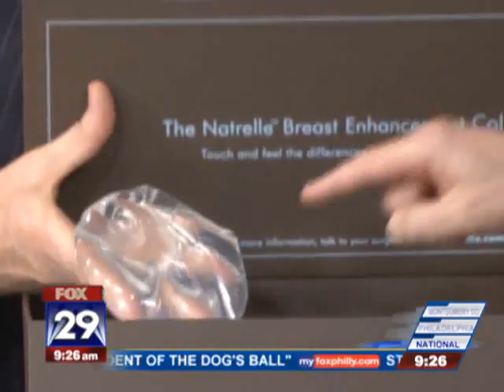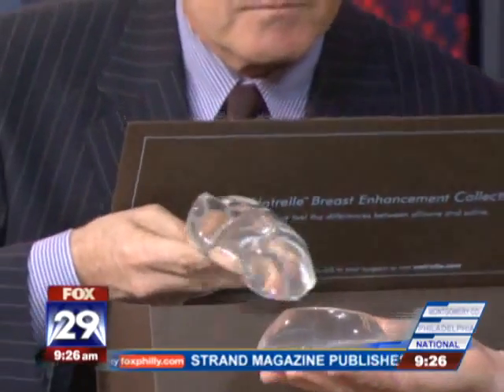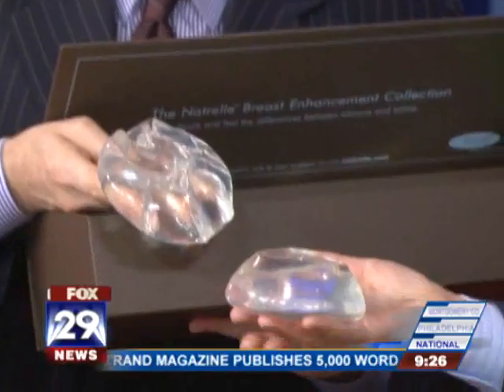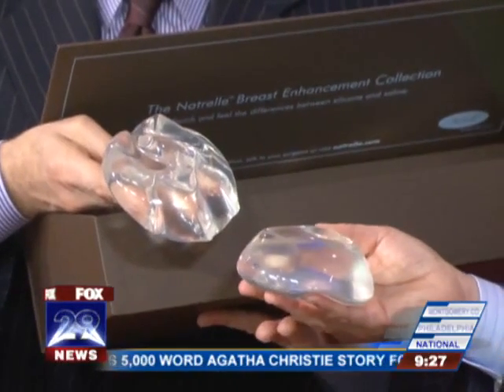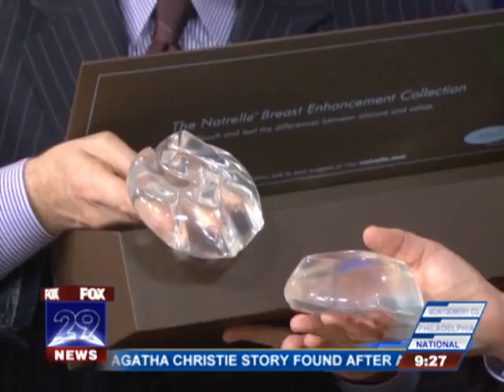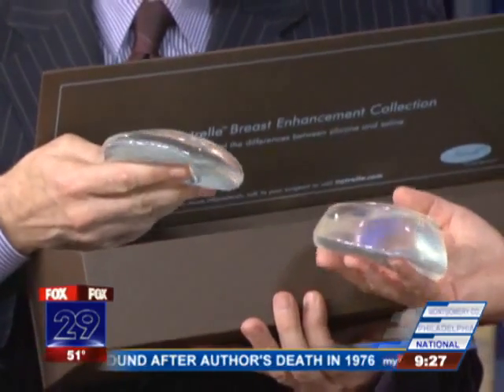I promise people I have a show inside the box. These are simply silicone. These are silicone implants. Breast implants. The interesting piece is that implant and this implant, if you look at them, are the same size. They're just a different shape. And so when people say, I want a 300cc implant, they can be completely different. One's more like this and one's more stacked up. Yes, because there are 350 choices today of implants. That's why people need to see what they're going to look like if they can do it.